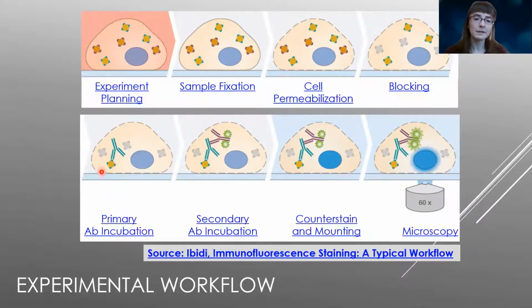So in this example, they've shown a primary antibody where we've sent in something unlabeled and it's binding the target antigen, this yellow protein. And then following that with a fluorescently labeled secondary antibody. And you can see here that we get specific binding to this target. The secondary, for example, would be an anti-mouse antibody, and the primary was mouse anti-human, and maybe this was a human cell.